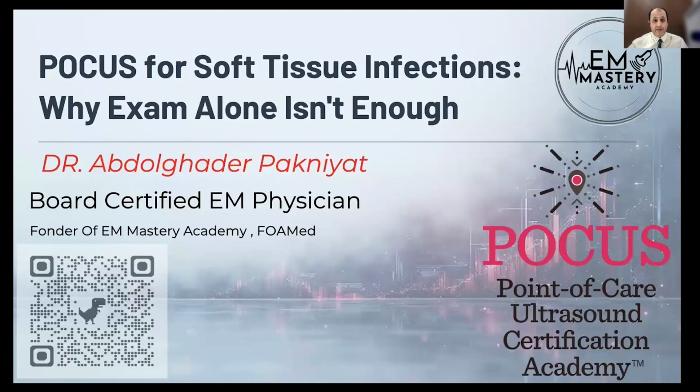For me, as an emergency physician, when I am thinking about the highest quality care, POCUS always comes to my mind. Without POCUS, I question how I can give the highest quality of care and do my best for the patient, because sometimes our hands have limitations and we cannot detect every pathology just using our clinical skill and physical examination.